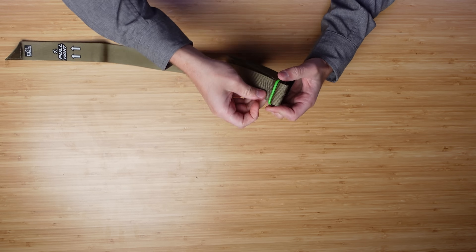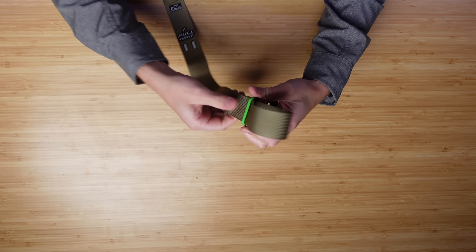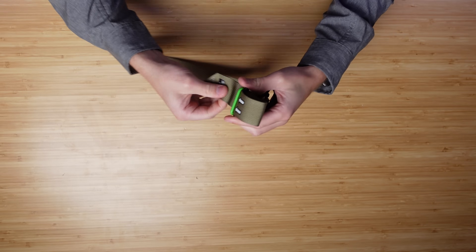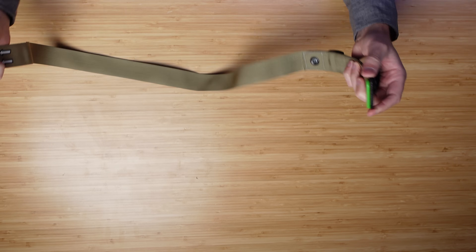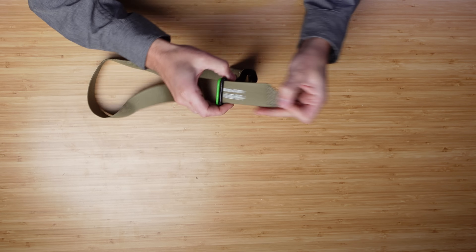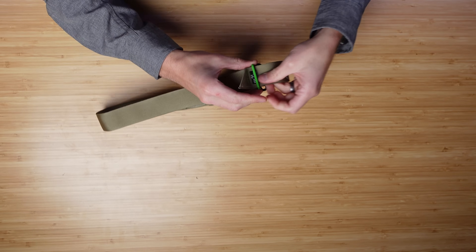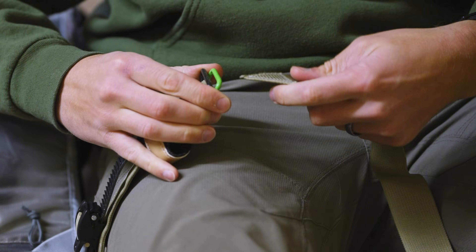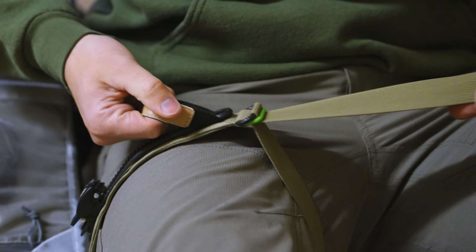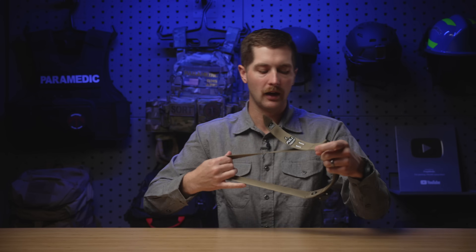If you have a leg entrapment, or you're trying to take this strap apart to throw it around the leg, as opposed to just looping it up the leg, that's where this thing has some limitations. We can get it really big — it could go around pretty much anybody's leg — but if I want to take it apart, I have to unfeed the strap completely out of both buckles. It will work, you absolutely can do it, but it does require a lot of fine motor skills to thread it through, and even in the studio with just the adrenaline of filming, it's a little hard to do. That's more difficult than taking the CAT tail and putting it through its lock, or the buckle mechanism on a Soft T Wide. So if you think there's a need to tourniquet an entrapped extremity, that's a limitation to consider.